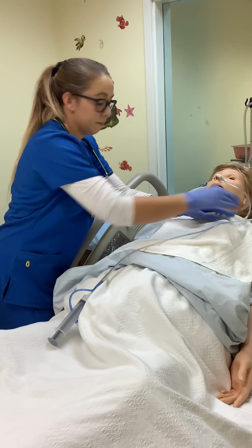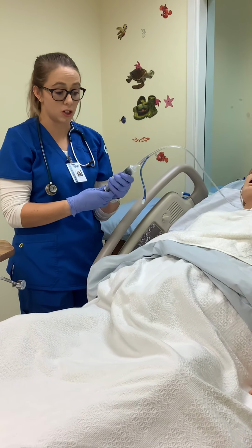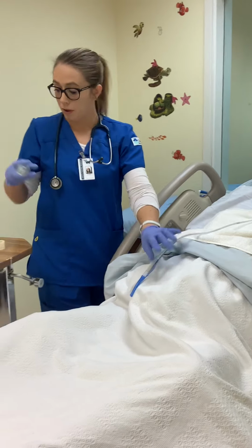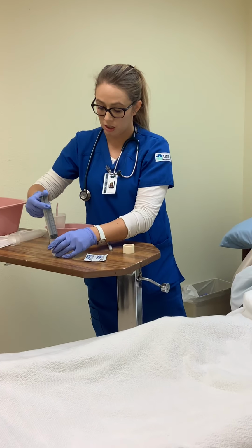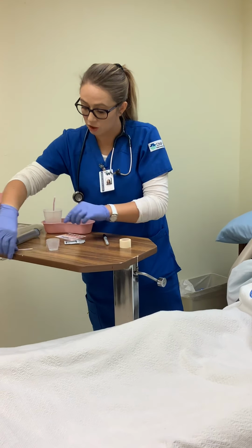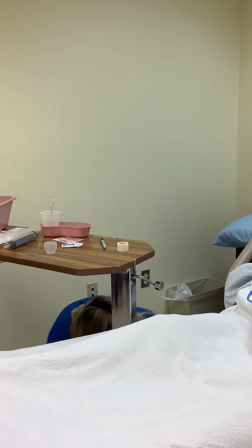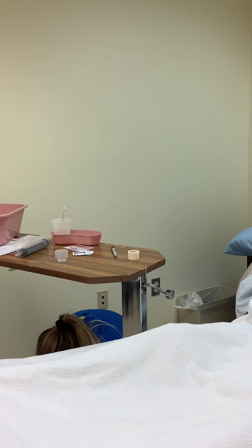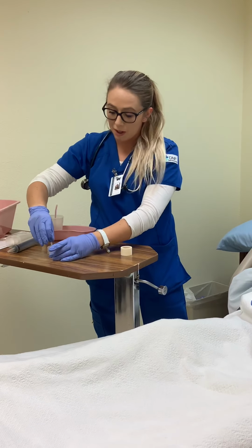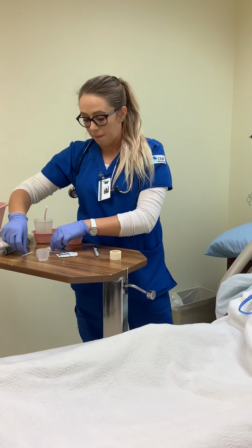Okay, good. Then whatever is in here, if there's enough, I can just pull it, or if there's not and you need a little more, you can pull down. So I'll do that, and I'll put this into my medicine cup. And this is where I would dip in my pH stick if I don't drop it. Oh, I can't pick it up. Oh my goodness. There we go. I wouldn't drop it, but I just did. Okay, so then you would dip it in, and check to make sure it's acidic, ranging from 1 to 4. Okay.